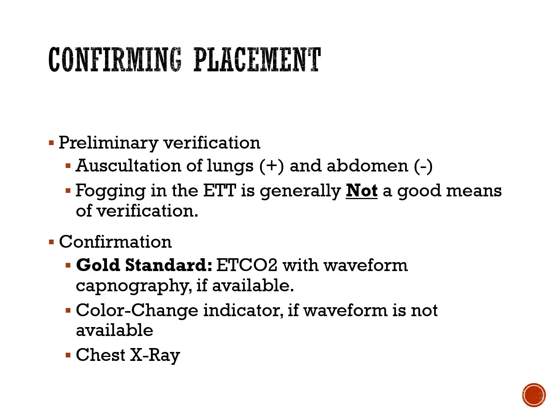Critically important is confirming placement. We've mentioned this several times during this presentation, but if you can't tell by now, I'm a firm believer that important points need to be reaffirmed. So confirming placement, preliminary verification: auscultation of the lungs and the abdomen or the epigastric region. You want breath sounds every time that bag is squeezed, and you don't want to hear a lot of gurgling over the abdomen when they're squeezing the bag.